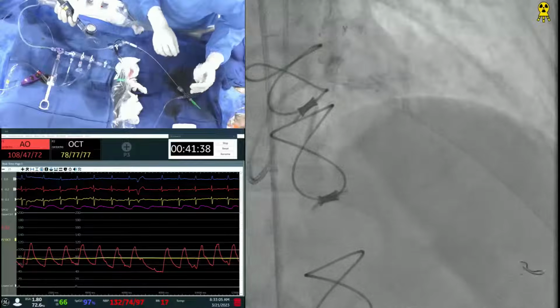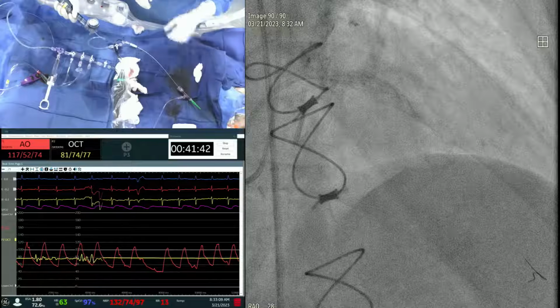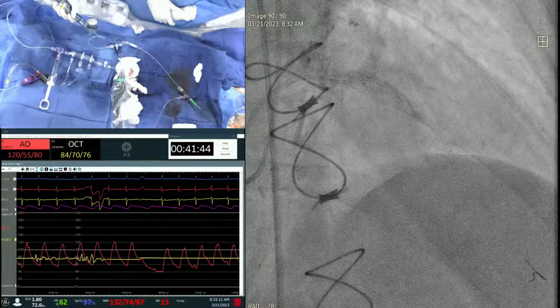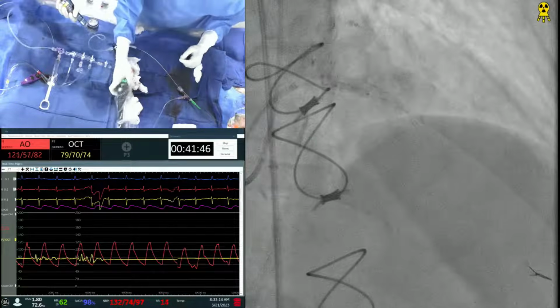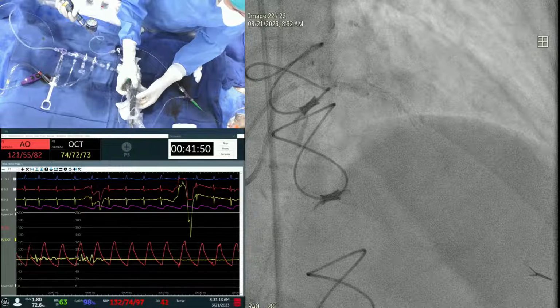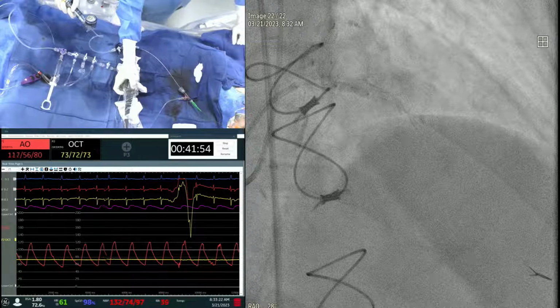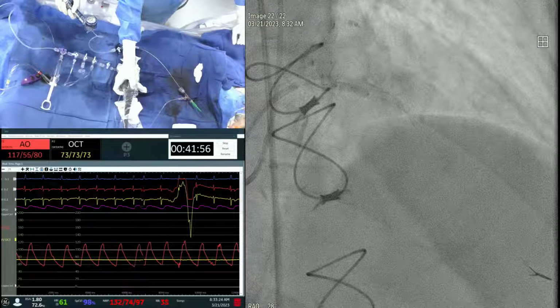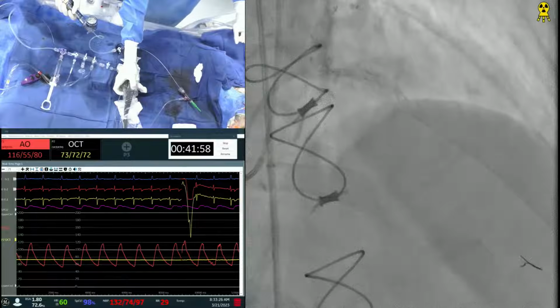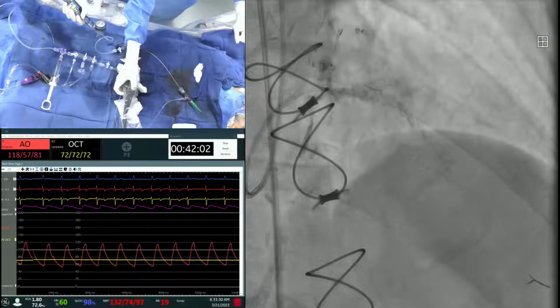Actually, how many times they did a post-dilatation after the IVL. After the stent, yes, everybody was post-dilated. But only the pre number was shown. Maybe I have to look into that paper a little more, how many were post-dilated after the IVL. Because I think if the IVL balloon is fully expanded, probably you don't need to post-dilate. But if the IVL balloon is not expanded, then definitely you have to post-dilate before you put a stent.